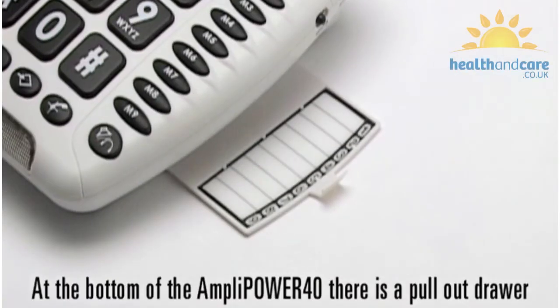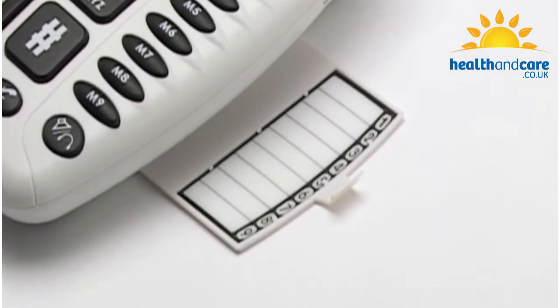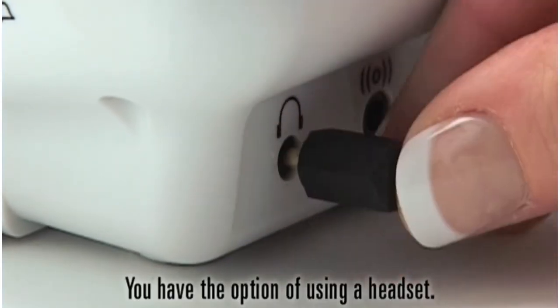At the bottom of the AmpliPower 40 there is a pull-out drawer where you can make a note of all your direct memories. With the AmpliPower 40 you also have the option of using a headset.